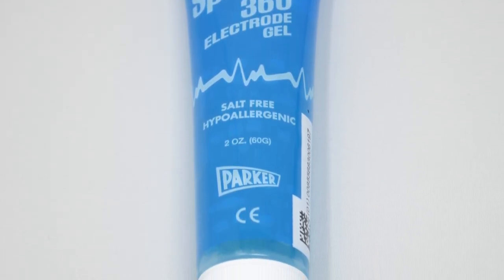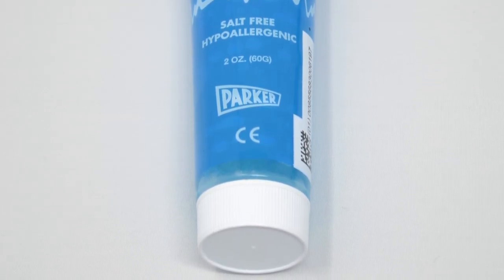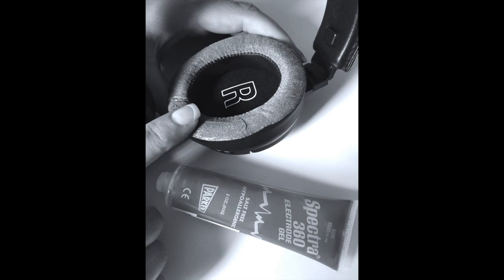You can order additional gel by visiting our website or from various online stores. Only use this type of gel with the Cervella device. If you do not have access to gel, please substitute water, but never use Cervella without wetting both the skin and electrodes, as skin irritation may occur.